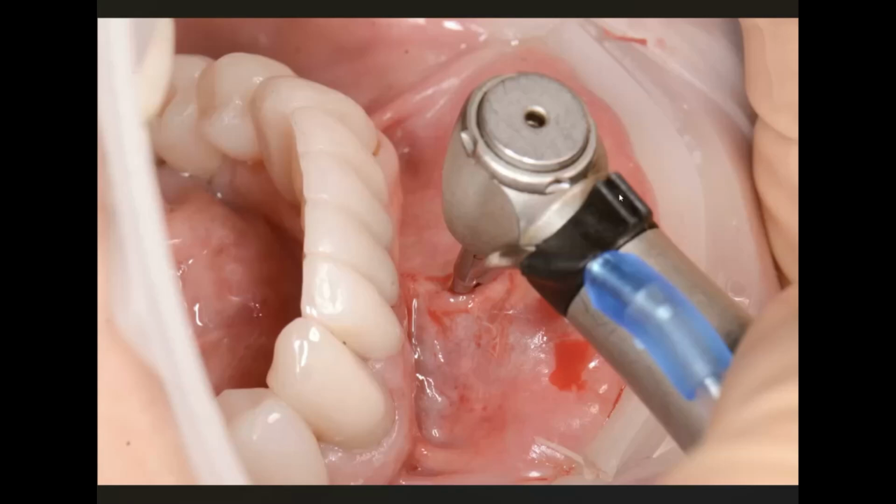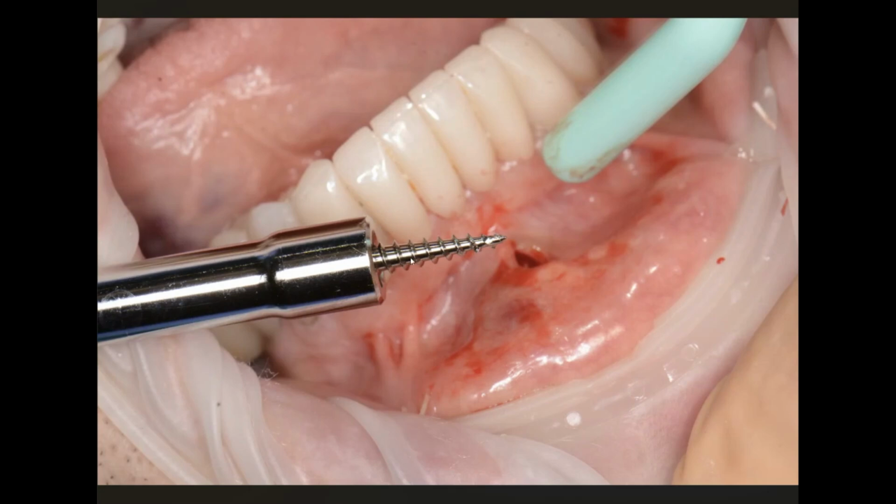So I make a hole, and then we've got the bone screw with the MUA on it. This is the AIM Fiducial. It's called AIM for Atlantic Implant Marker for the Atlantic Implant Institute. Again, made by Danny Domingue at LA Labs.